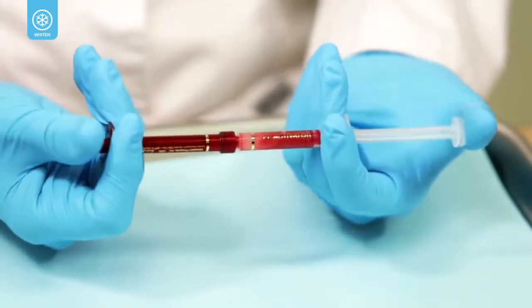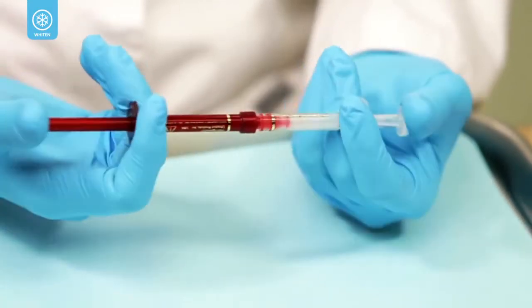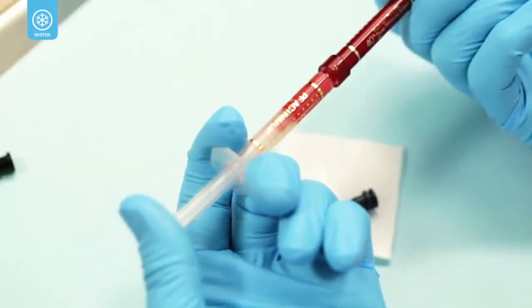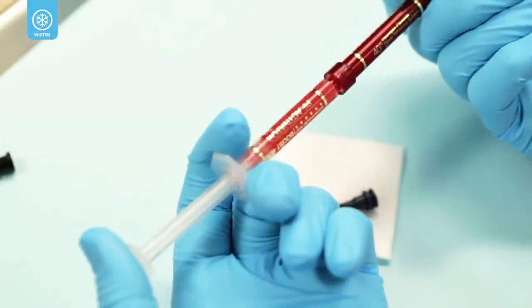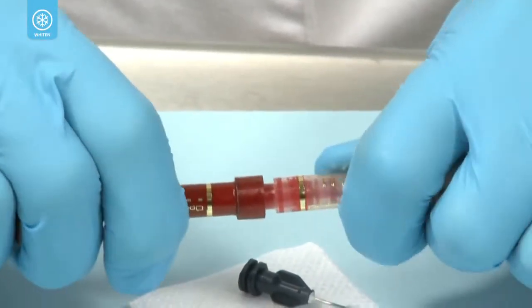Continue depressing the clear plunger so all of the gel is in the red syringe. Reverse the action and mix a minimum of 50 times total or 25 times on each side. Be sure to finish with all the mixed gel in the red syringe. Twist to separate the two syringes.